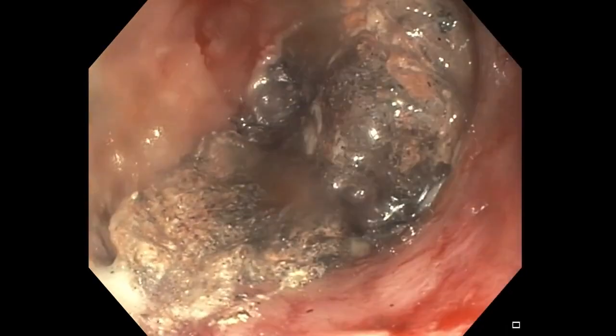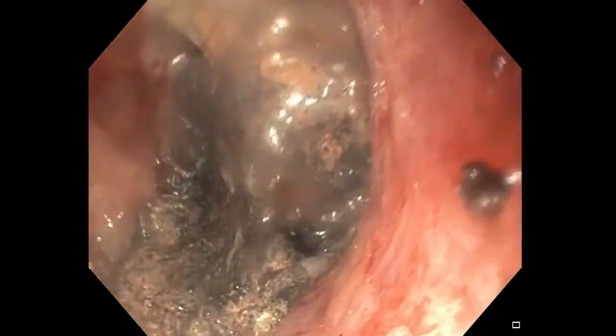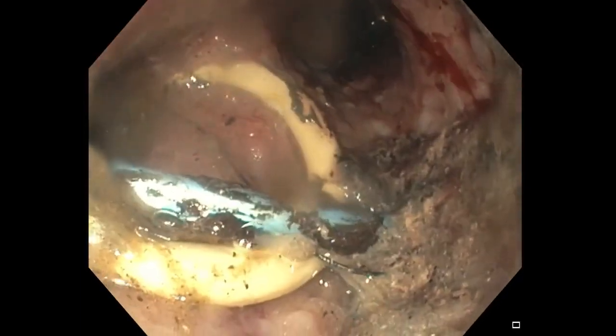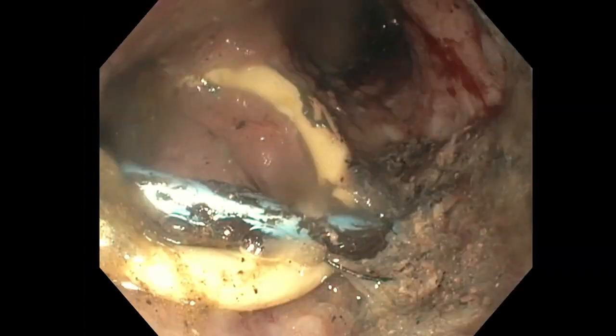So we have nearly completely evacuated the necrosis. There's a small amount of residual, and here you see the percutaneous drains in place.